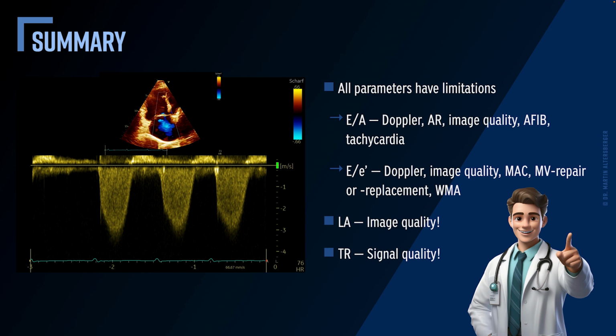In this case, it's probably moderate. You can see over here a dilated right ventricle, and the right ventricular function is reduced, and sPAP can be calculated in this area. So it's around 3.1 meters per second, translating, of course, then into an sPAP measurement in millimeters of mercury. Be aware that due to the reduction in right ventricular function, there might still be an underestimation of this gradient present.